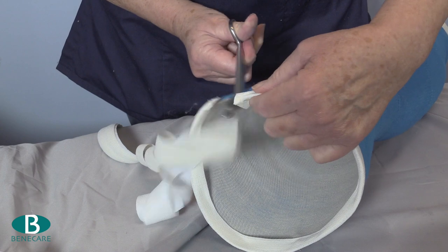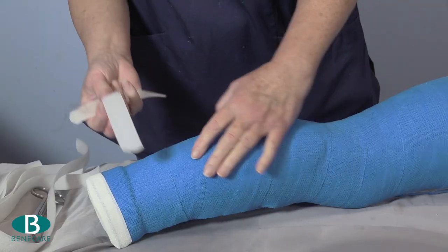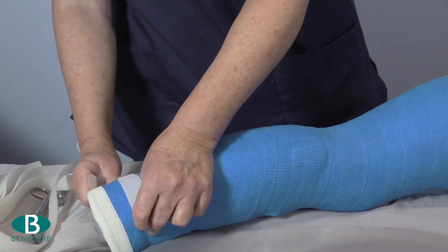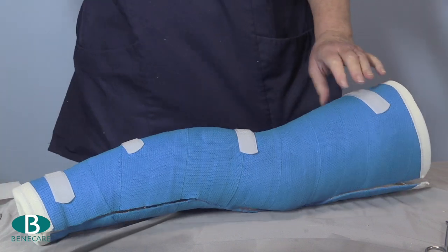Apply 4 or 5 pieces of adhesive hook directly to the cast on the posterior aspect, and then secure this with non-adhesive loop wrapped circumferentially.